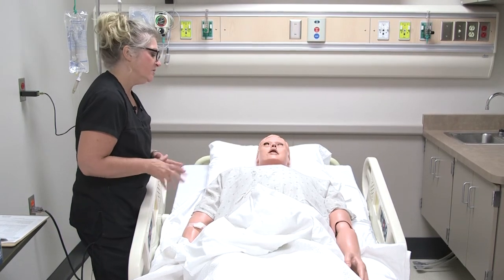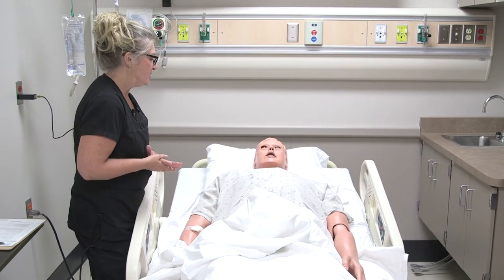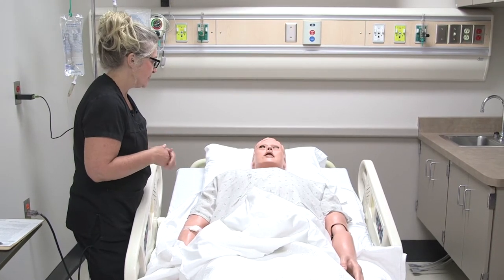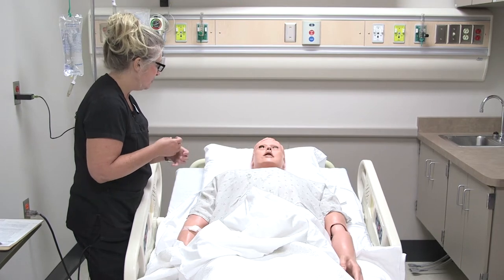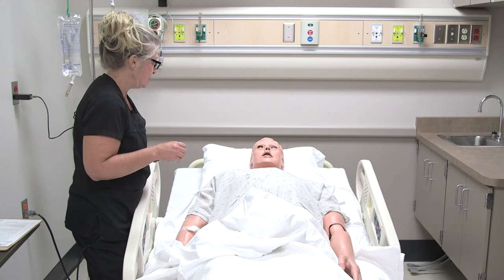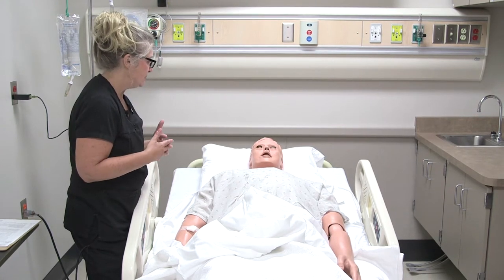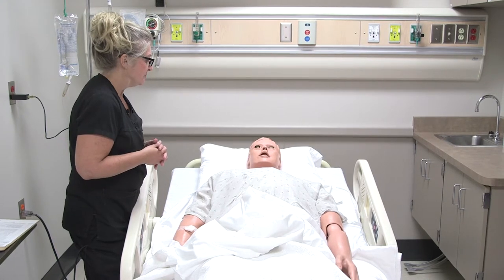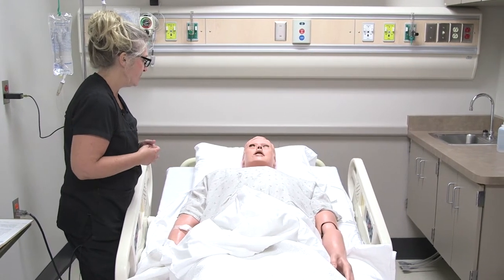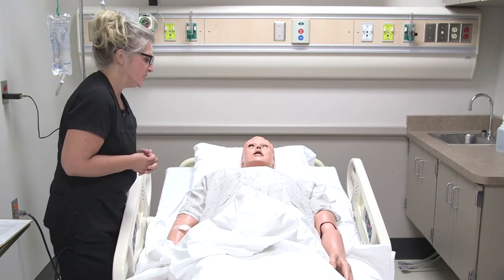No. Okay. And I'll just explain a little bit of what I'm doing the whole time. So the tube does actually go right into your urinary opening, and it does feel a little uncomfortable as I'm putting the tube in, but we'll be helping you through that, making sure you take deep breaths, and that kind of helps the process along, so it's not as uncomfortable as it could be.